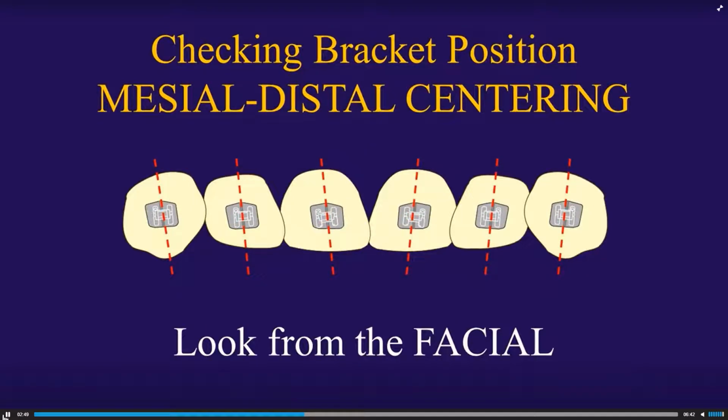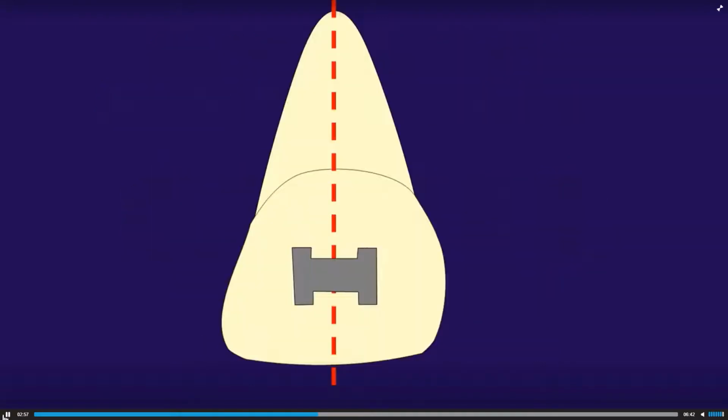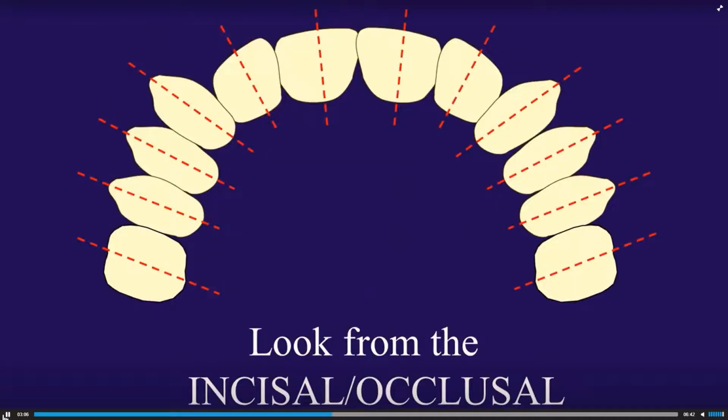Now what you're going to do is check your mesial-distal centering of that bracket, first from the facial aspect. And it should look something like that, right? You have the center of the bracket right along the center of the tooth. Now, very important, probably the most important bracket placement trick you're going to get: now double check it from the occlusal view. Now, why is this so important?